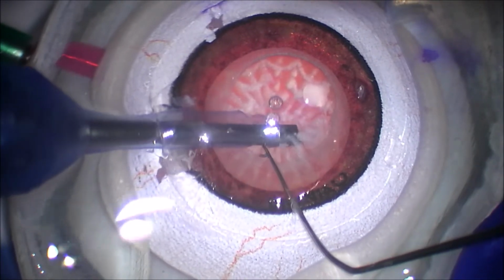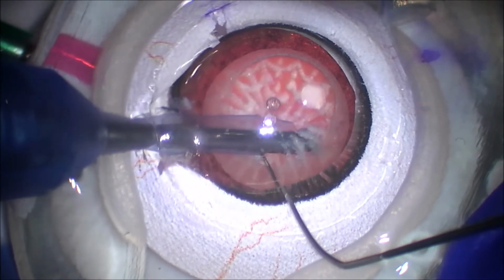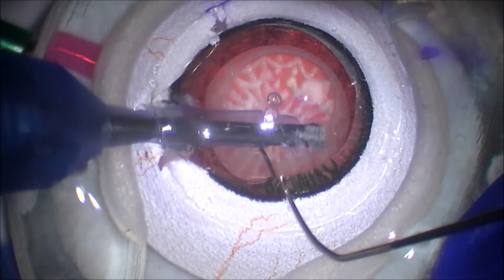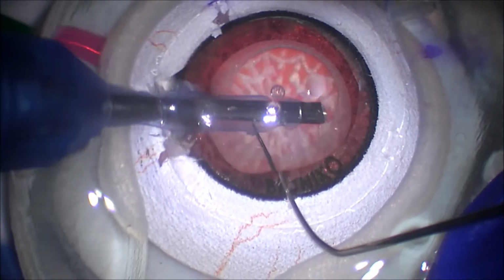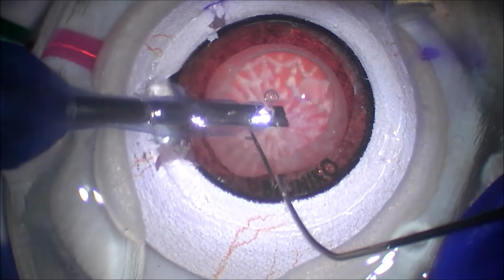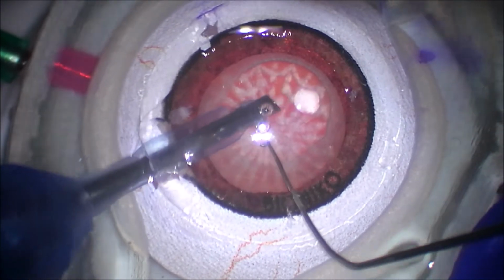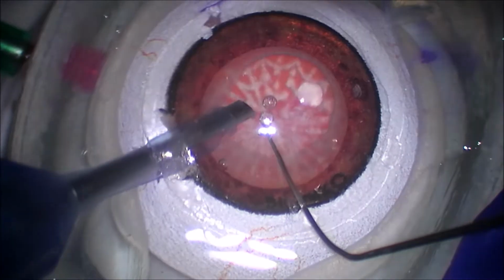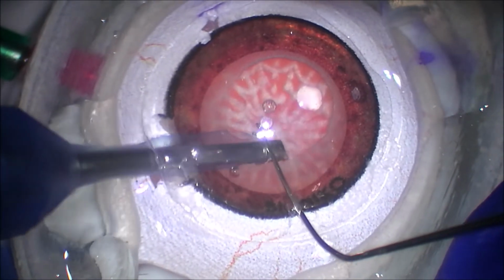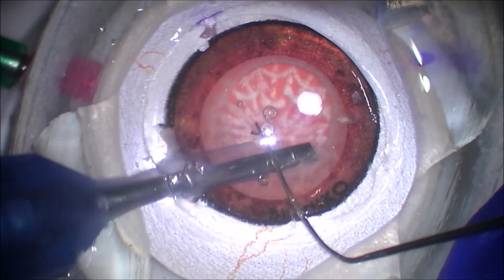It is important for her to understand that she can apply aspiration vacuum out there in the corners, but be very mindful and wary of applying ultrasonic energy when she's got the phaco probe so close to the posterior capsule. And so she's heeding my advice, and she's been very careful, just aspirating and also doing vacuum when she's out beyond the central safe zone, trying to grab those pieces, again, mainly because they're not mobile.